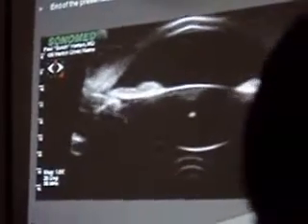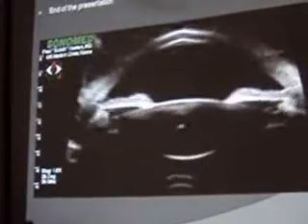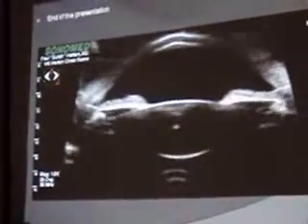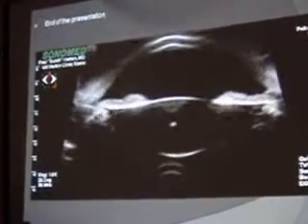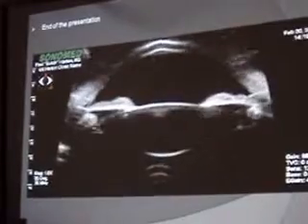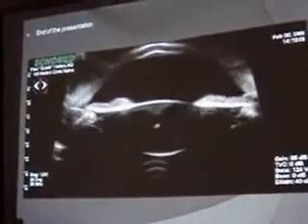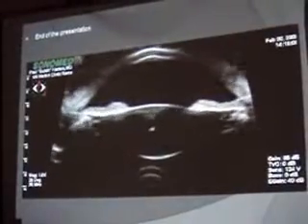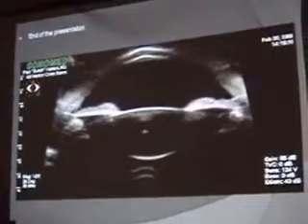It's very complex to make the patient understand what you're asking him to do, because we need a 6 meter far target and a 33 centimeter near target that we used to do through a mirror. The mirror must be perfectly placed, focusing the target at 6 meters, for the patient to avoid convergence. Otherwise, when you are capturing, the eye is moving, and it's a little bit complex to show.